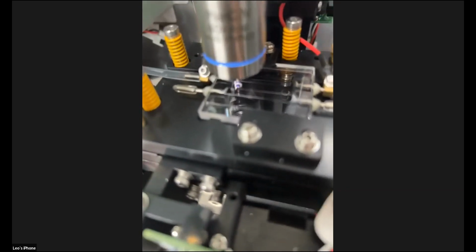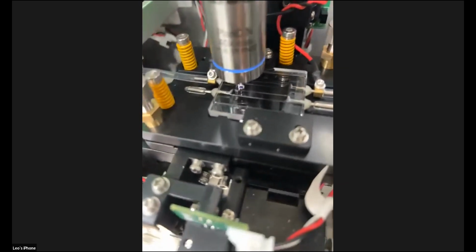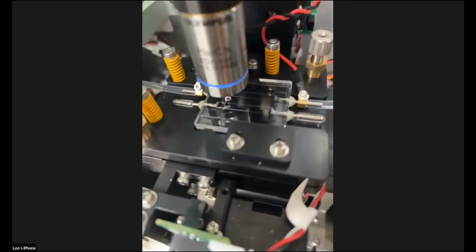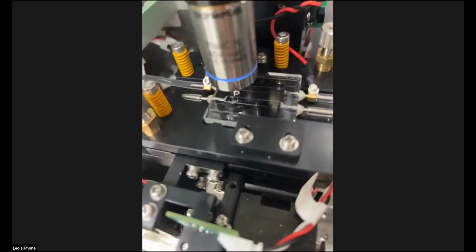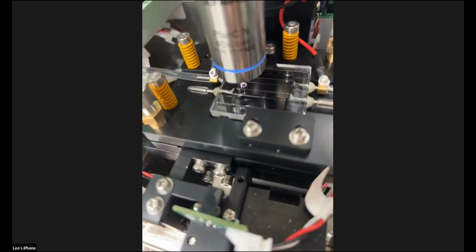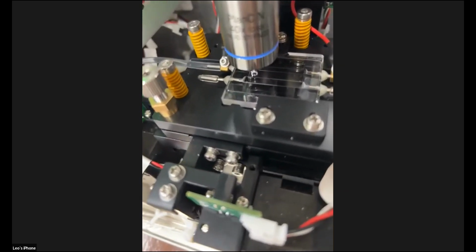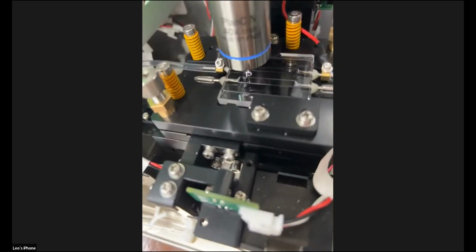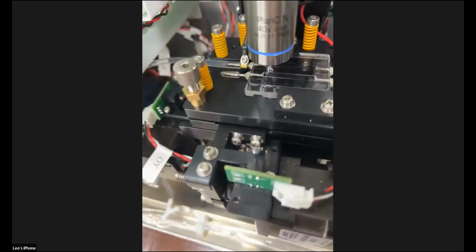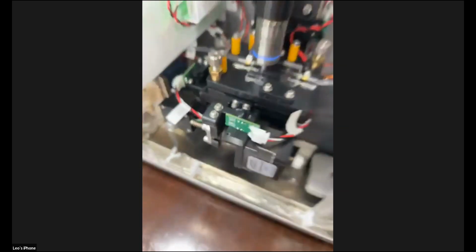And then for the replacement of this flow chamber, we also have a special guidance document for our customer. If one channel has leakage or something abnormal happens, you can use the other. If both channels are broken or damaged, you can replace the whole flow chamber unit. We also have a guidance document to share with you. Okay, I think this is about the flow chamber.